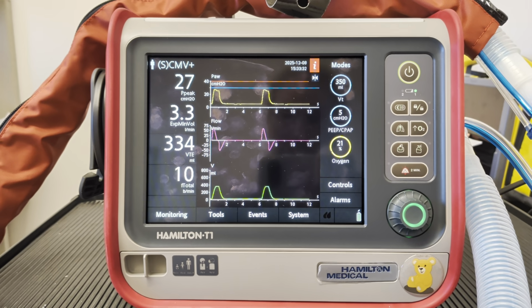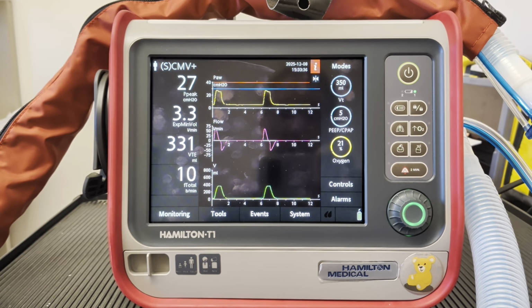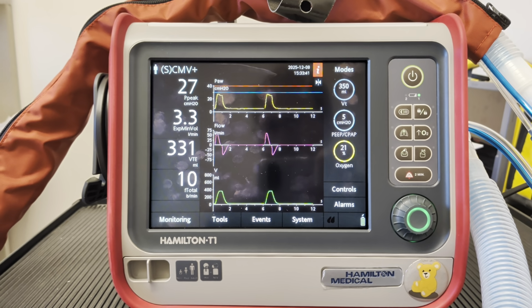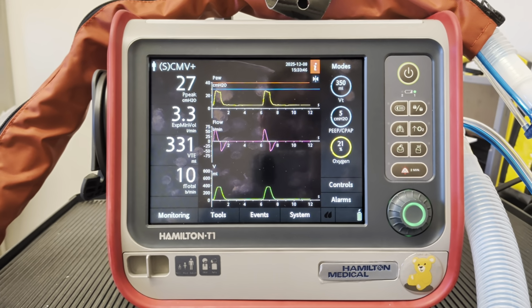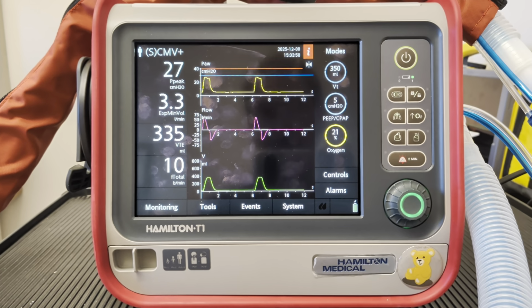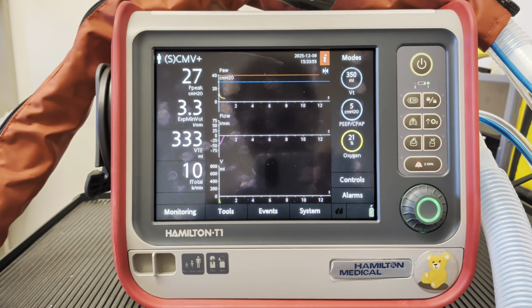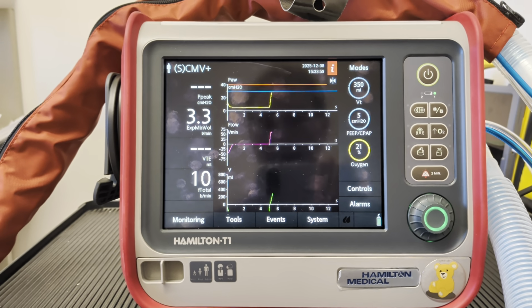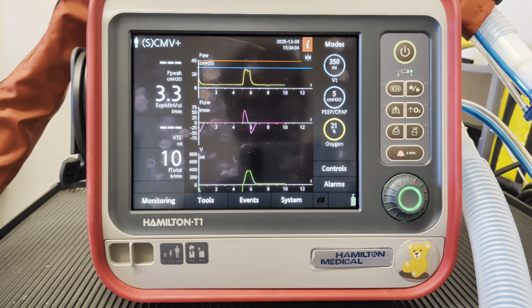Obviously, there are some pitfalls there. When you increase airway pressures, you risk possibly overextending the lungs and causing volutrauma and barotrauma in certain patients, right? And so you have to be careful there as well. There is really no free lunch when it comes to mechanical ventilation. But with that in mind, what are the primary ways to increase mean airway pressure?